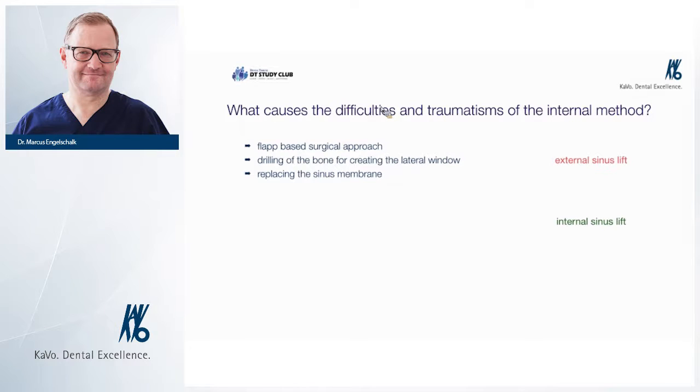And now the most interesting part, in my opinion, the feedback system. Well, you have a clear feedback if you have the classical window, because you can see it. If you have no feedback, then you will have the feedback at the end of the healing period or during the healing period if the patient gets an infection or not.